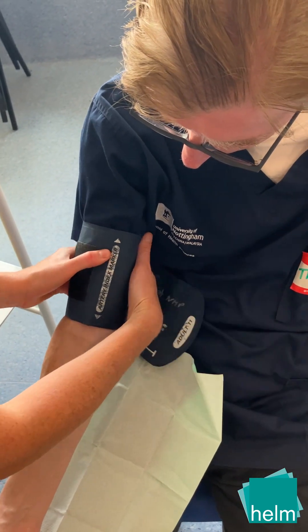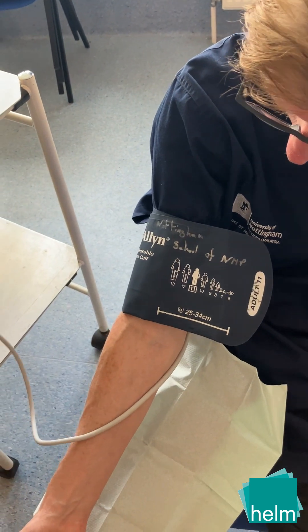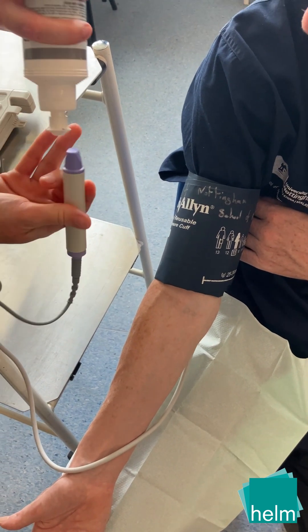Apply the blood pressure cuff with the arterial marker aligned to the brachial artery. Here, a Doppler probe using ultrasound will project the sound of the brachial pulse until the cuff occludes the artery.